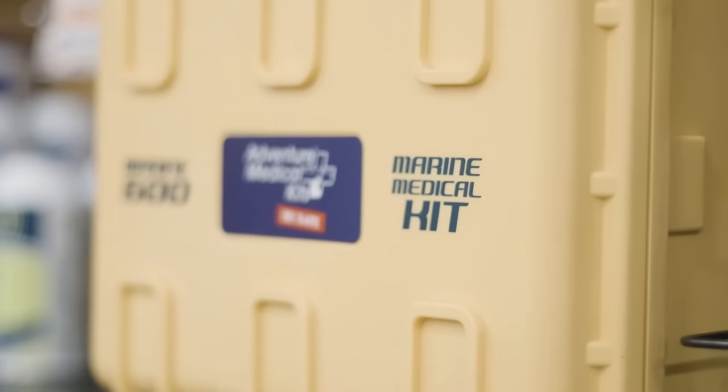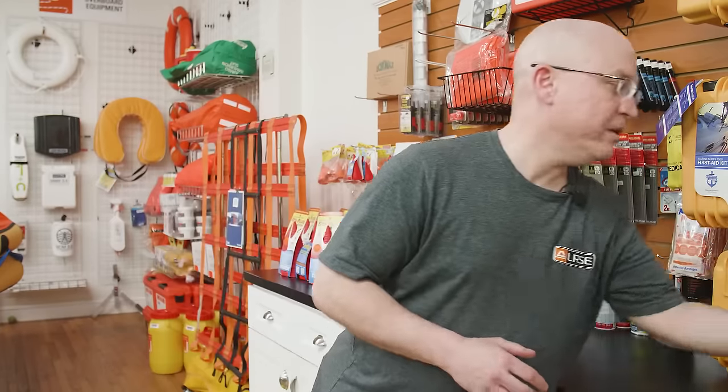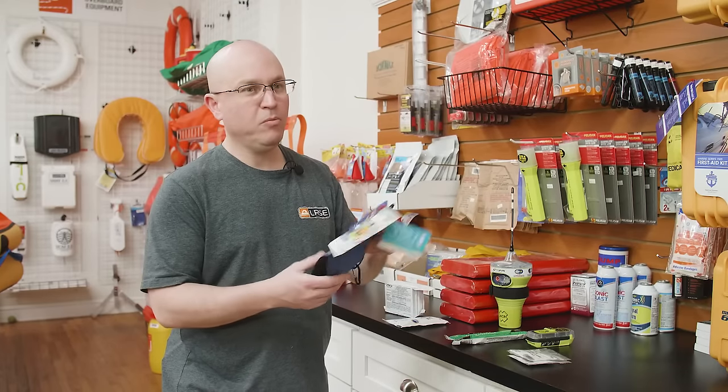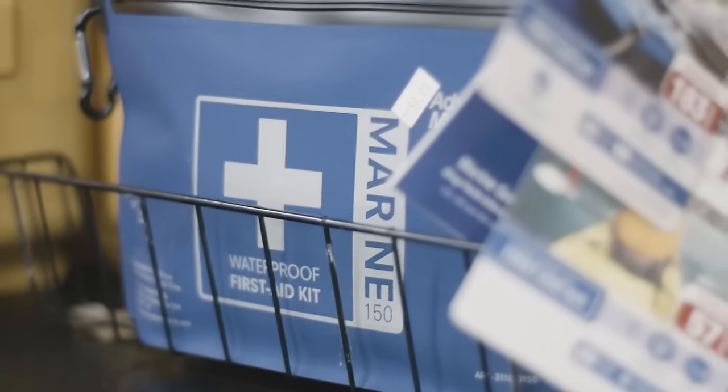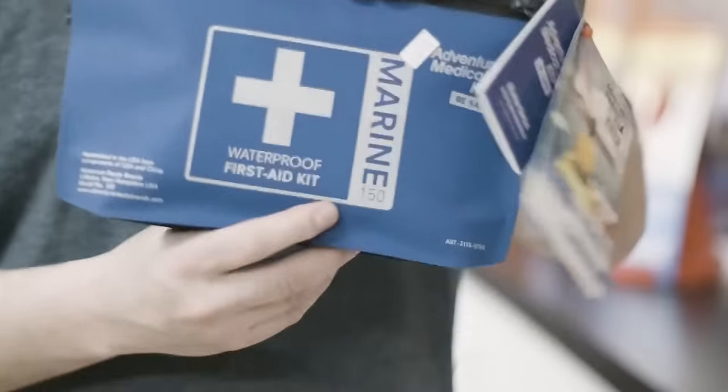Adventure Medical Kits has really done a good job of designing their kits around specific boaters. So we could go with something very basic, which would be the Marine 150, which is this one here. It's very small. There's not a lot of items in here — a lot of just bandages and gauze and basic first aid stuff.